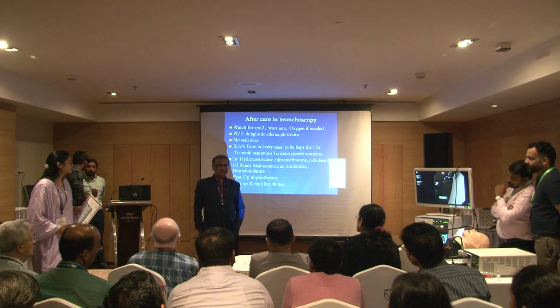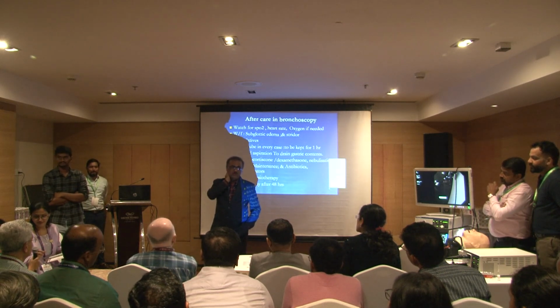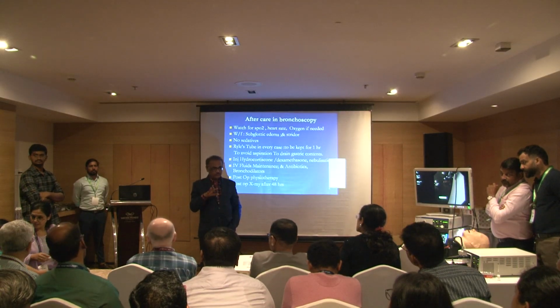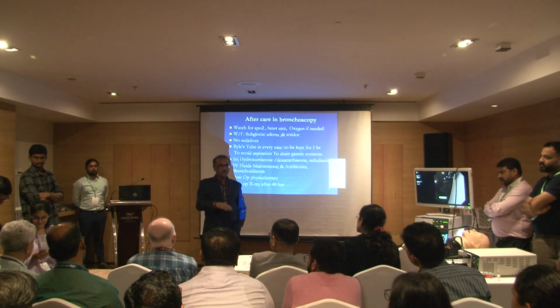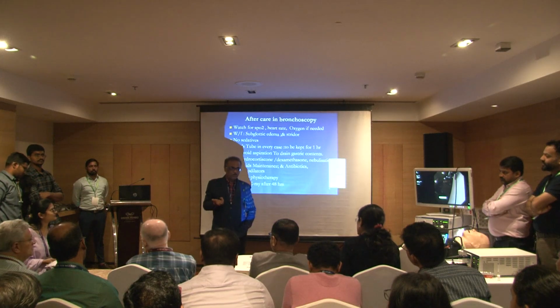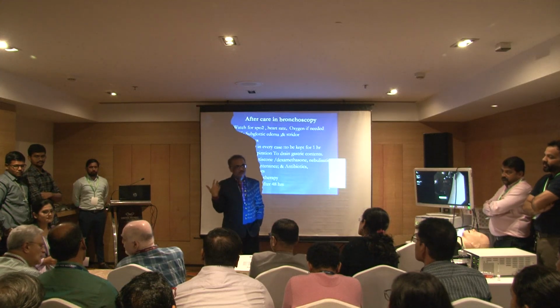The foreign body inside is not going to get cured. That time you have to come out, but the escape should be safe.